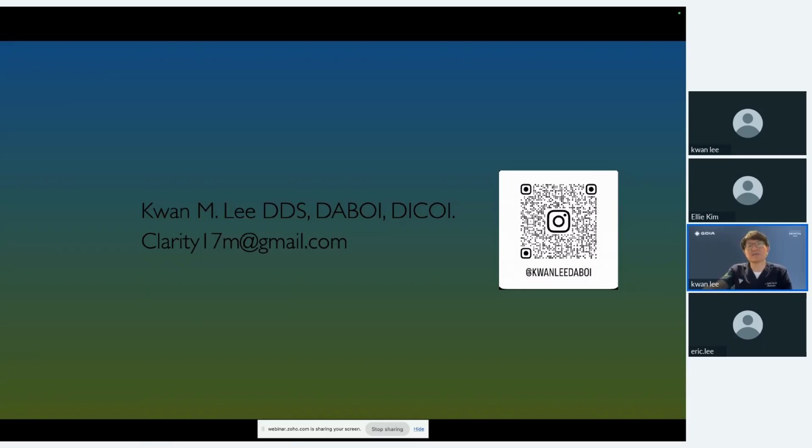But if you are doing the conventional, traditional crestal sinus, then you will have to look at the residual bone height, and plan out what kind of implant you're going to deliver. Let's say your existing residual bone height is 6 millimeters, and you want to deliver a 9 millimeter implant length, then you only need to elevate 3 millimeters. 3 millimeters of crestal sinus augmentation, anybody can do it. Osteotomy techniques, or you just drill it, adding some bone grafting in, and that will give you the 3 millimeters augmentation as well. So that's not a huge issue.